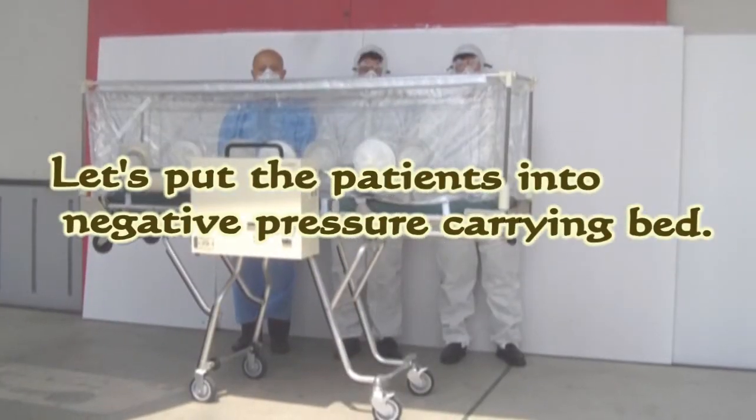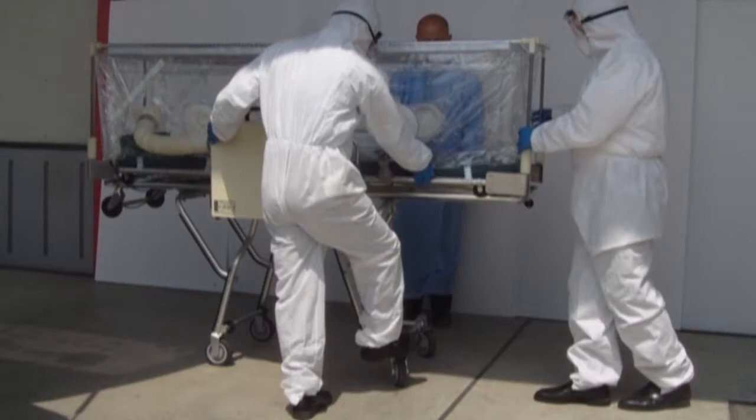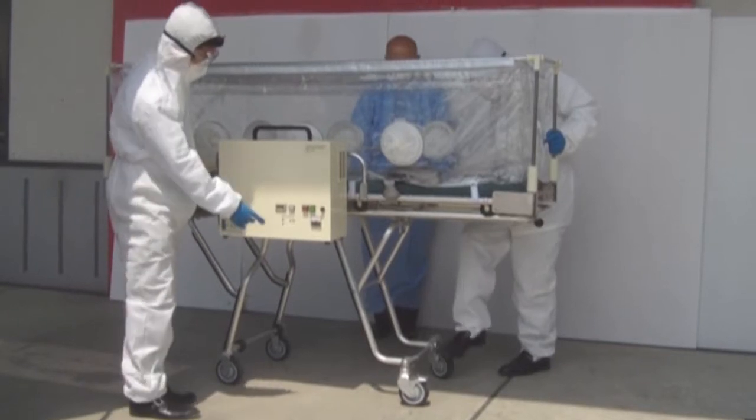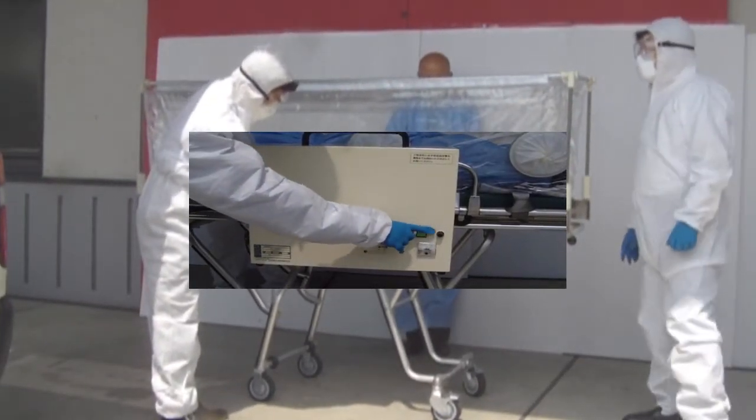Let's actually put the patient into the negative pressure carrying bed. The stopper of the negative pressure carrying bed is turned on and fixed. The green fan switch of the electrical fan box is turned on.